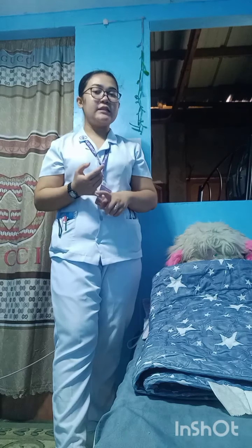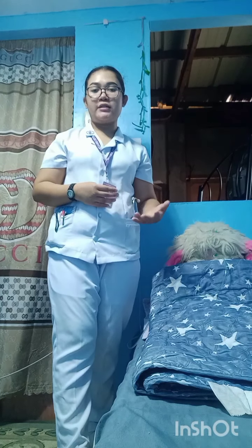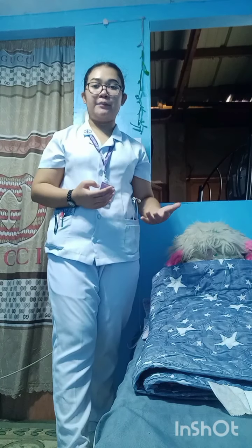So in assessing our client, first we're going to assess our client's vital signs, the level of anxiety, as well as the color, the ease of respiration, as well as we're going to provide support while the client is adjusting to the device, especially to those clients na mga first timer na oxygen therapy. So, kailangan natin sila provide ng support na okay lang to.